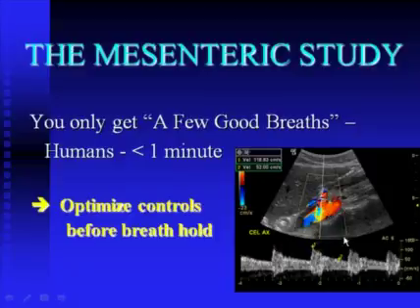You have your spectral Doppler display ready, your cursor is there, your sample volume is placed, and you're ready to go. So the instant they stop breathing, put your spectral Doppler sample volume in place, turn on your spectral Doppler display, get your recording, and in approximately 5 seconds you should have all the information you need, at which point you can tell the patient just go ahead and breathe normally while I check my image to make sure I got the information I need.